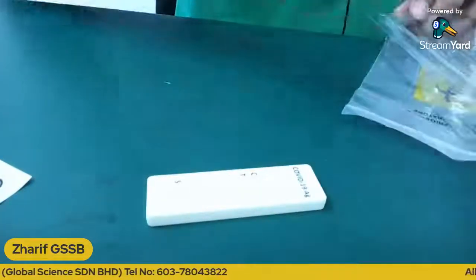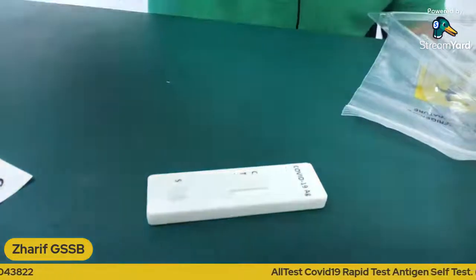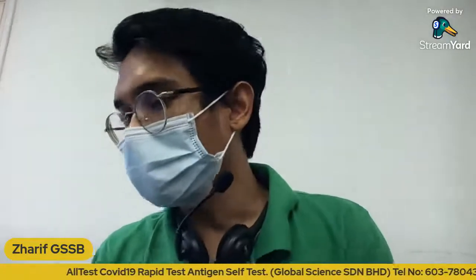Now, for you to read your results, you will have to wait for around 15 minutes, but not more than 20 minutes, because that's the time period for you to read the result. Once it reaches above 20, the result is no longer valid. Therefore, make sure to set an alarm for 15 minutes. So once the alarm is off, then you can check for your results. Okay, while we wait, I will show you how to interpret the result once it appears.